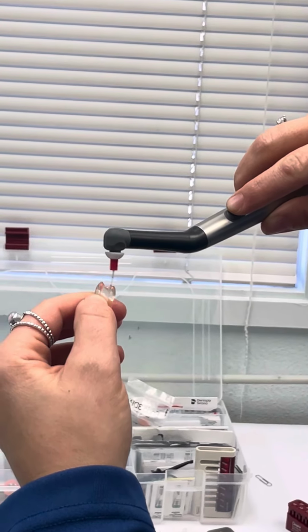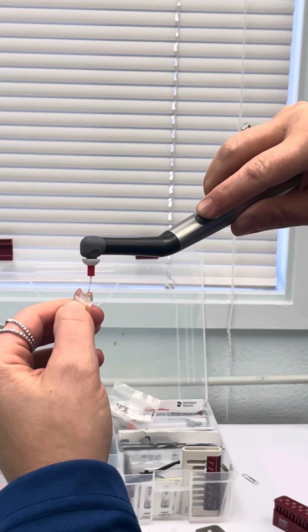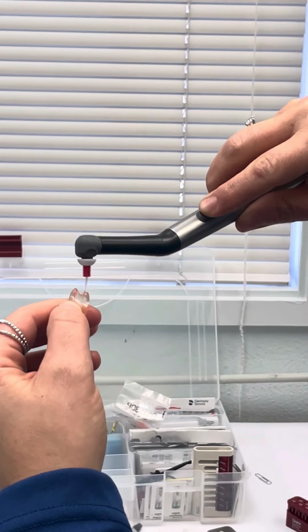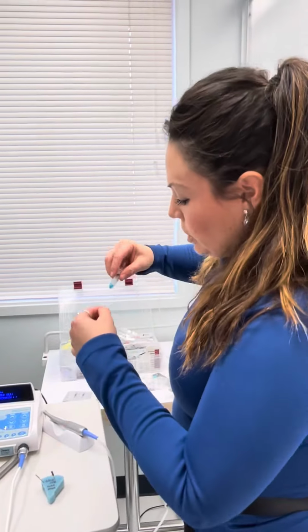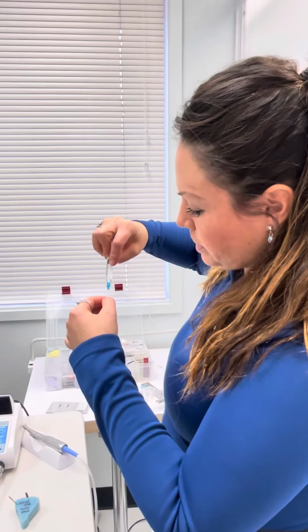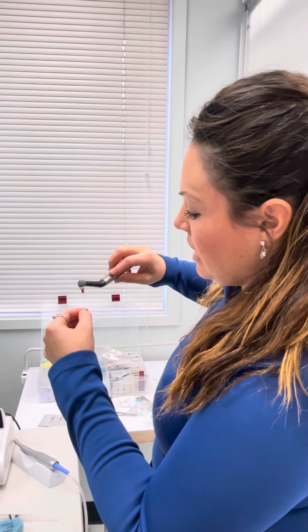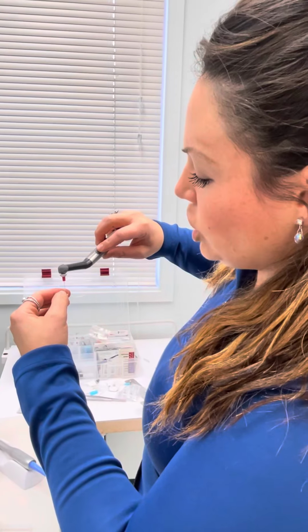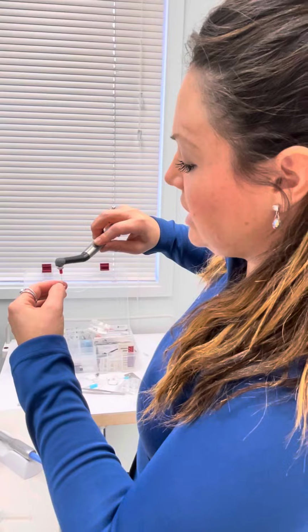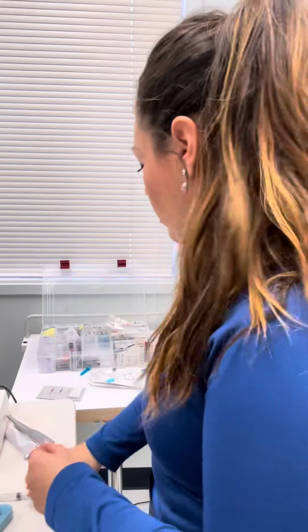At this point, the assistant's getting ready for obturation. She's getting her paper points, her gutta percha, she's getting her sealer, maybe she's moving some stuff out of the way. And then at this point, you're going to irrigate with your EDTA, chlorhexidine, give it another whirl. And then this is just like you would etch, at 15 seconds, whatever you'd like to do. All right, now we're ready to dry.